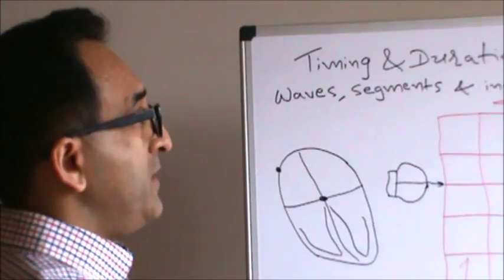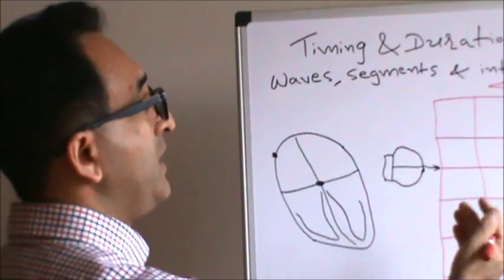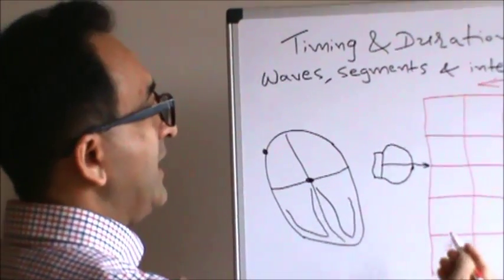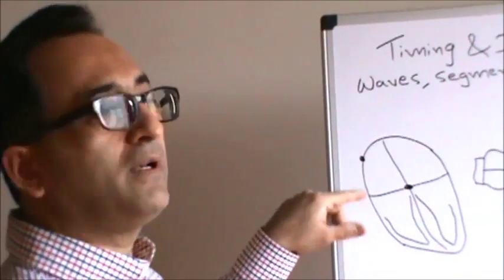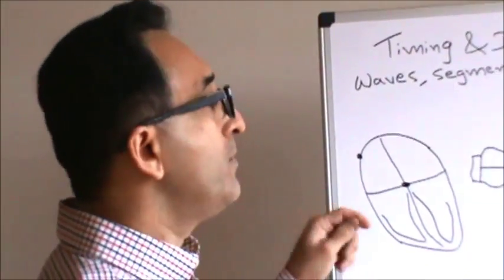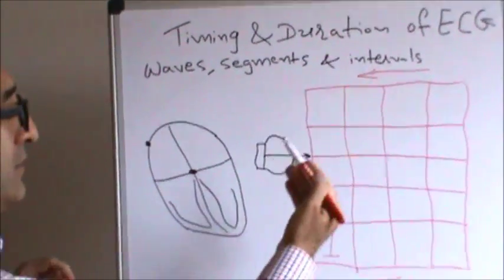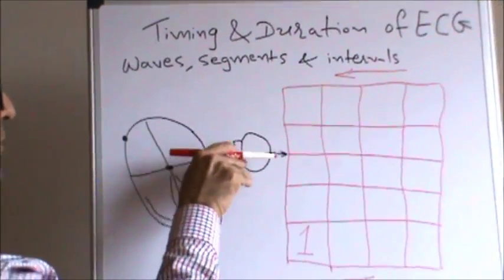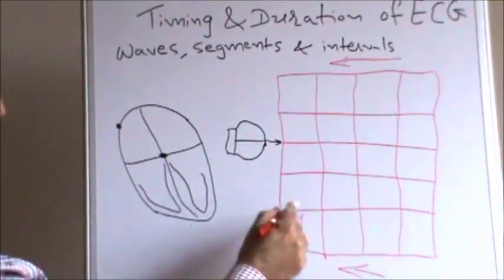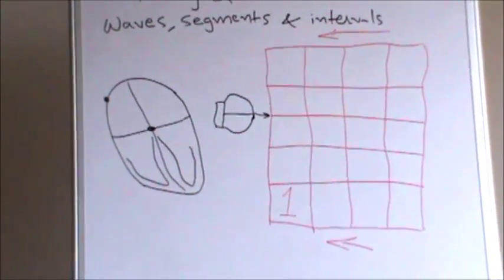If properly calibrated, the typical speed of the ECG paper would be such that in a minute, whatever electrical activity happens in our heart, the ECG paper, the way it rolls at that speed, and the needle that records, it can move 300 big squares like this.